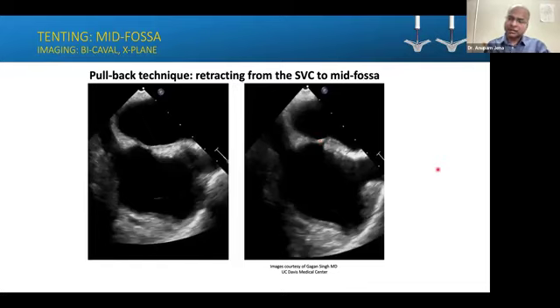For a functional MR, 3.5 is okay, but for mitral valve prolapse, the height of the puncture is absolutely necessary, because the coaptation plane is higher up in a mitral valve prolapse, whereas in a functional MR, like in this patient or heart failure patients, the coaptation plane is a little lower.